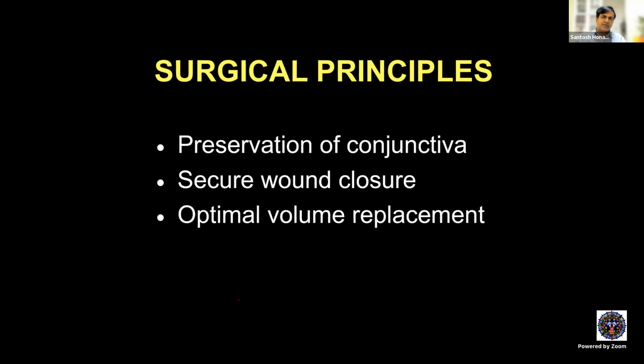Finally, place the implant in the intraconal space, close the posterior Tenon's, then close the anterior Tenon's and close the conjunctiva. So this three-layered closure will secure the wound completely. And whenever you close the conjunctiva, there's a technique of closure which I'll show you in the video.